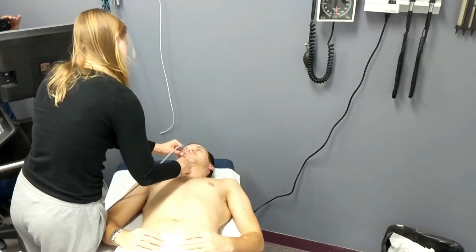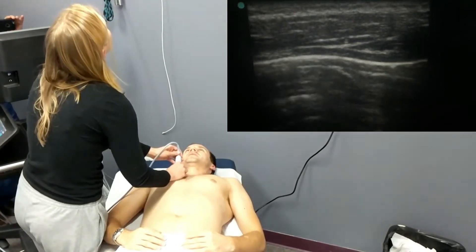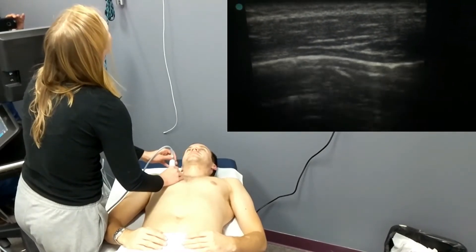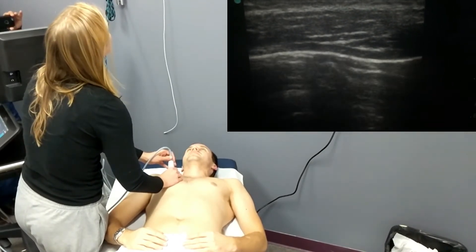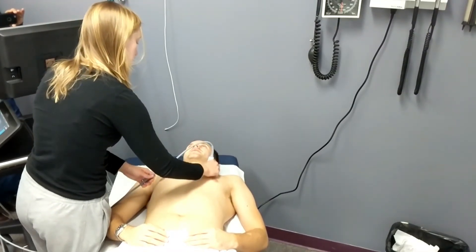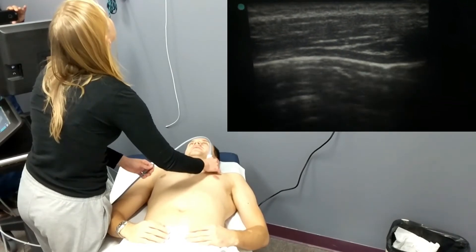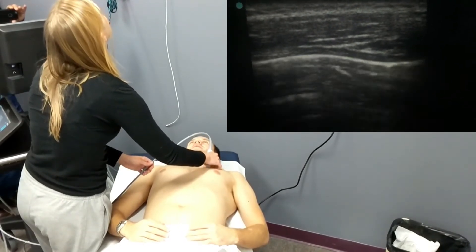She's now moving on to looking at the pulmonary views. She's watching the pleural interface to make sure that there is sliding, ensuring that there is no pneumothorax or any other fluid collection in this area. She does this bilaterally.